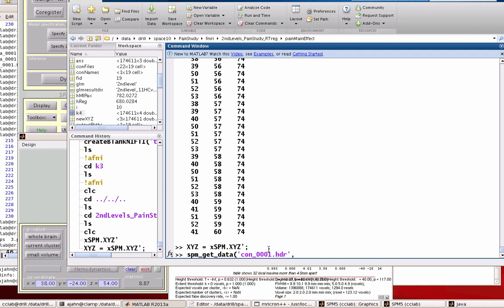I'm looking at, say, the mean effect of pain, because this was a study where I shocked people because basically I'm an asshole. That's kind of what it boils down to. I tell people it's for science, but that's not true. I'm gonna shock people, yeah.